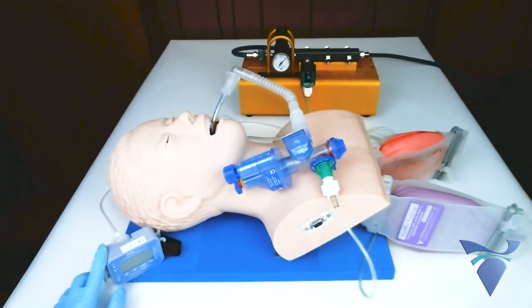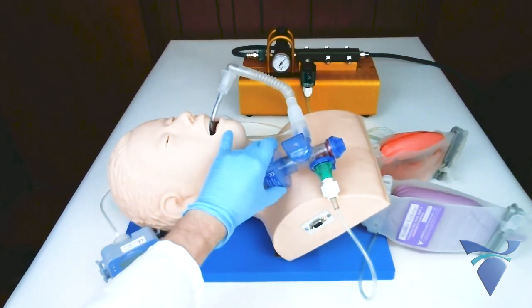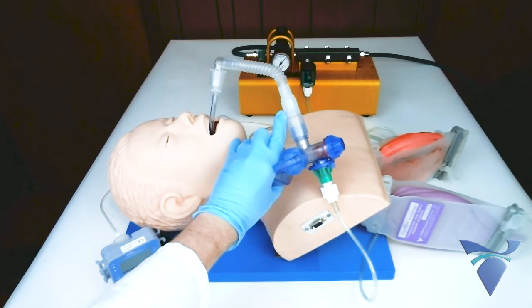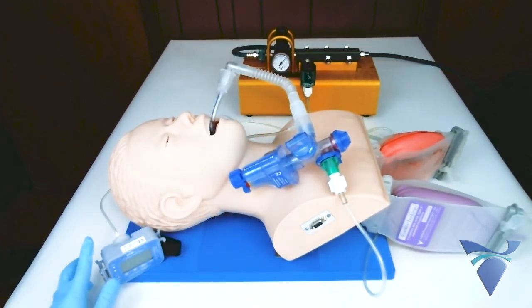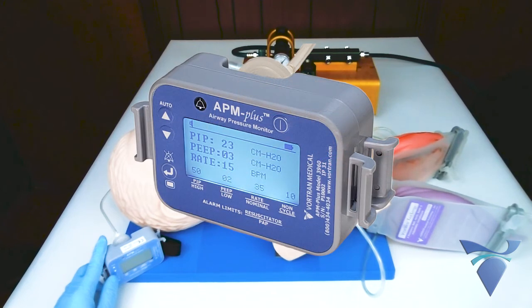Lastly is the Vortran APM Plus, an airway pressure monitor. The APM Plus is connected between the GoToVent and endotracheal tube and will provide real-time monitoring for PIP, PEEP, breath rate, inspiratory time, and IE ratio.